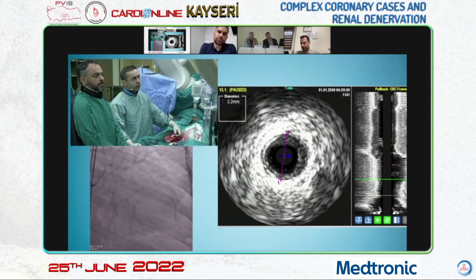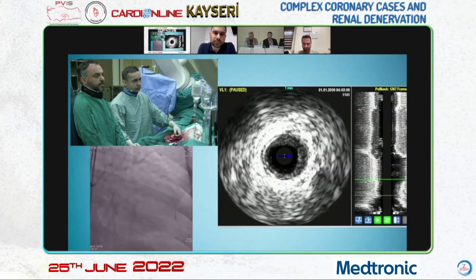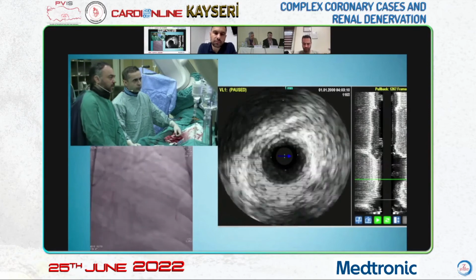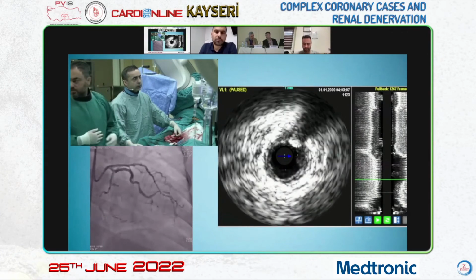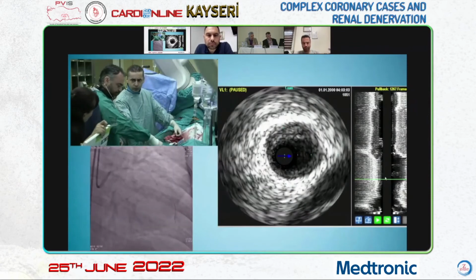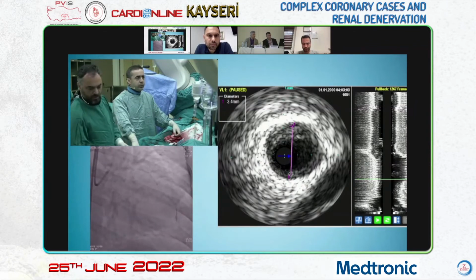I think there could be a narrowness from that part, and the proximal segment is a stent, so we can think of a balloon into the distal, or dilatation can be thought of. Of course, I have a concern about this part in the CTO cases.